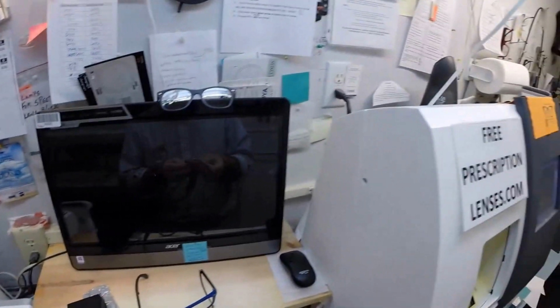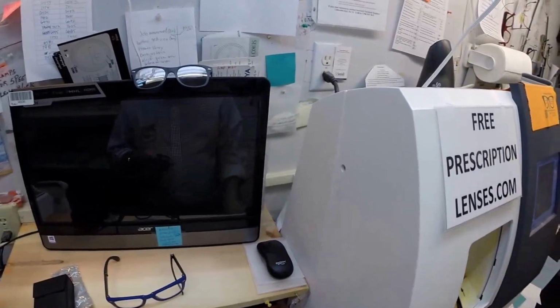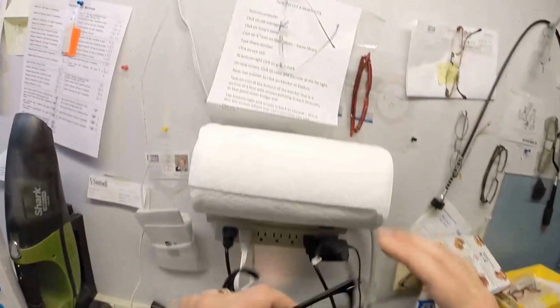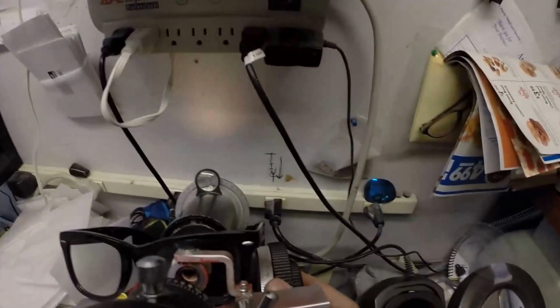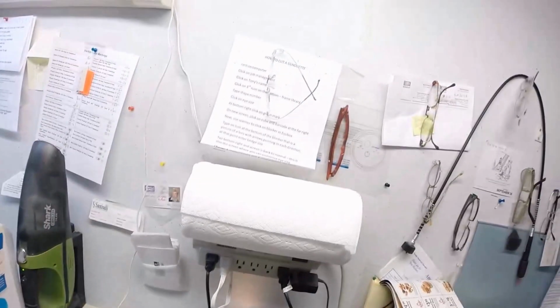And I'm going to go ahead and tuck that in at the outside corner, and then push down at the nose. It snaps right in easily. Pop that block off. Now, actually, let's come back down here again. Let's double check the prescription of the left eye. Put that in above the red dot. And again, I'm getting plus 50, exactly halfway between 0 and 1. So that is cut perfectly.